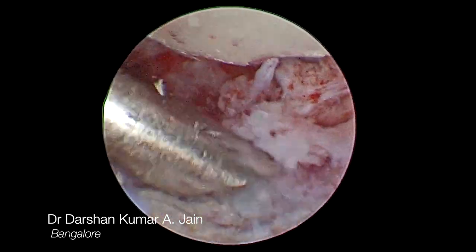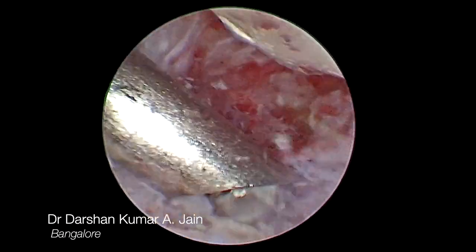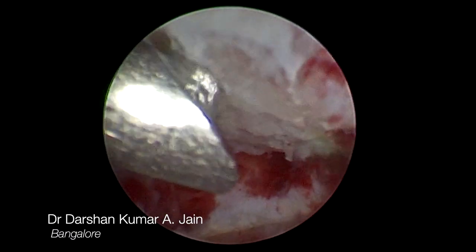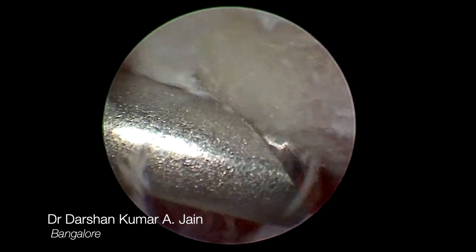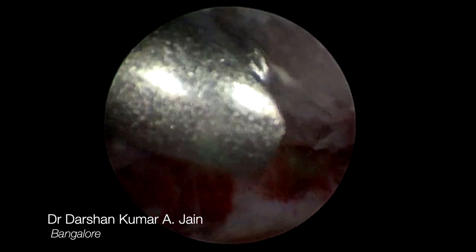The focus was primarily on the radius, where the scaphoid fossa and the lunate fossa were debrided, and the articular surface of the lunate and scaphoid were also debrided. It was ensured that the subchondral bone was exposed and punctate bleeding could be confirmed.